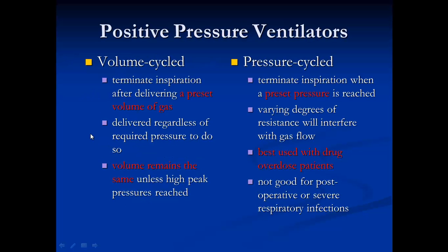So in other words, in volume cycle, it terminates inspiration after delivering a preset volume of gas or tidal volume. The delivery is regardless of required pressure, and the volume remains the same, so it is not taking into account the patient's effort.